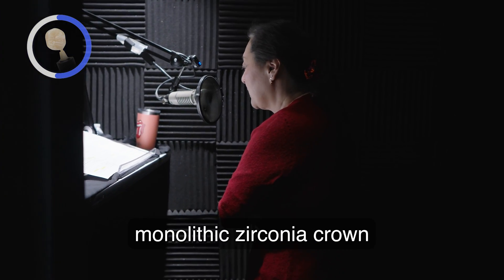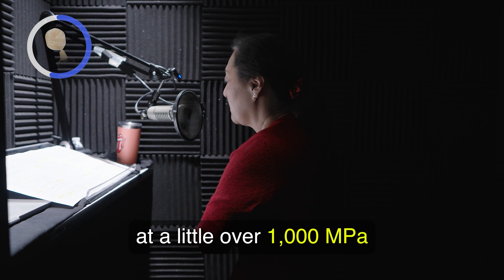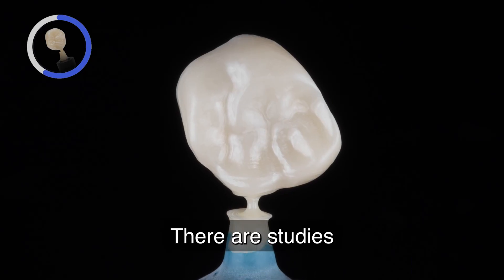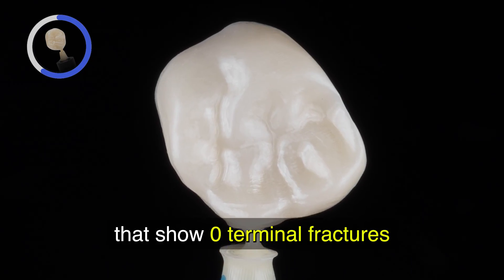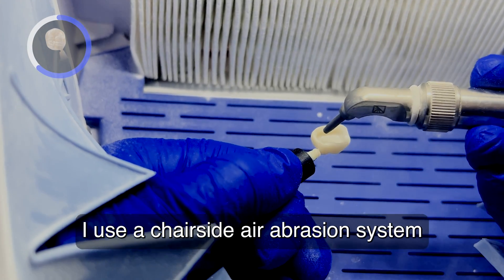BruxerNow is a monolithic zirconia crown that is extremely strong at a little over 1,000 megapascals, and it's extremely beautiful to the patient's eye. There are studies that show zero terminal fractures even after 10 years of service.